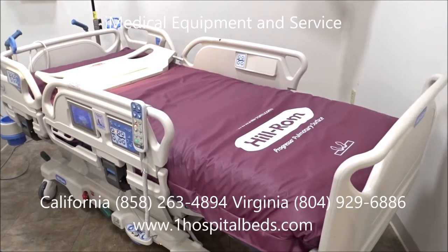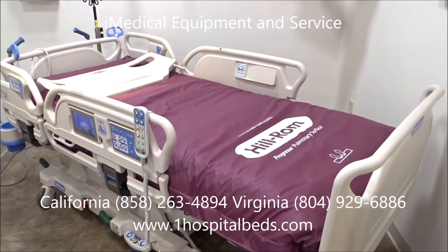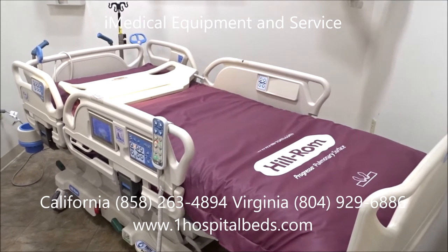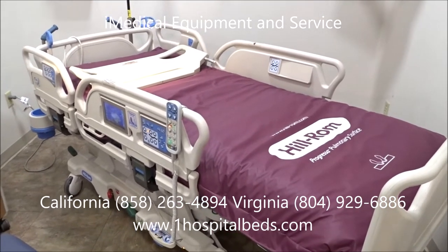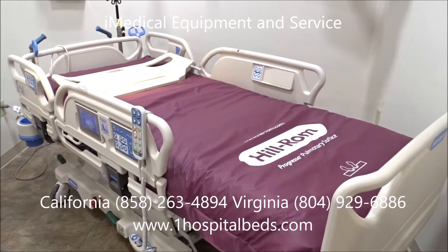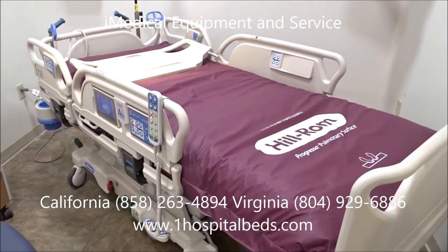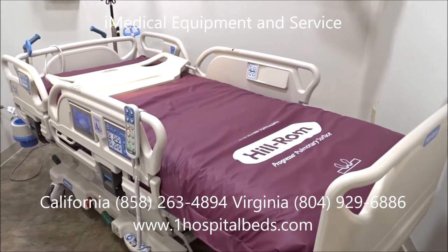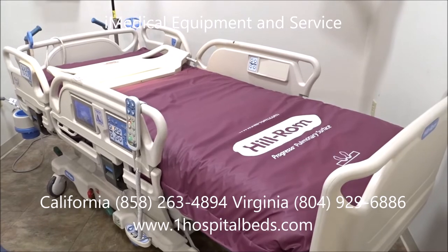We're at iMedical Equipment and Service looking at the Hill-Rom Progressa Hospital Bed, and I'm going to do a quick demo on the pulmonary feature, also referred to as percussion vibration. I've taken a footboard off of a Total Care Sport bed to show how the feature works. The percussion vibration feature is used to break up upper respiratory congestion in the lungs. In a hospital setting, a respiratory therapist or nurse could come in with suction to help remove it — this basically replicates what a respiratory therapist would do.